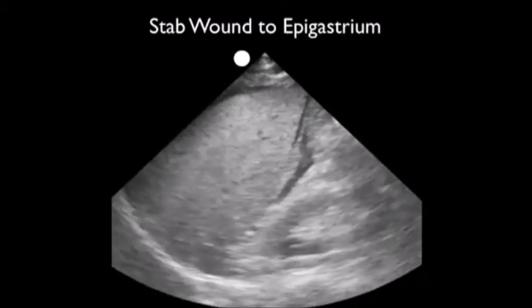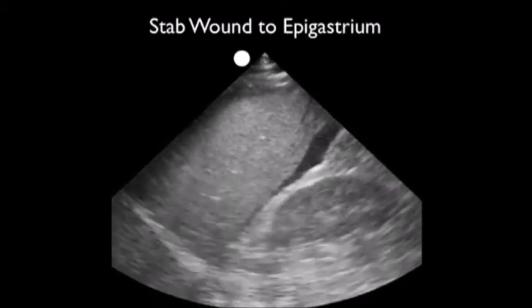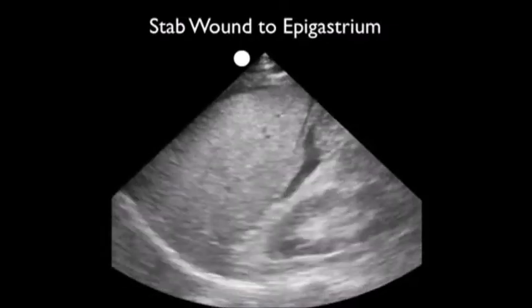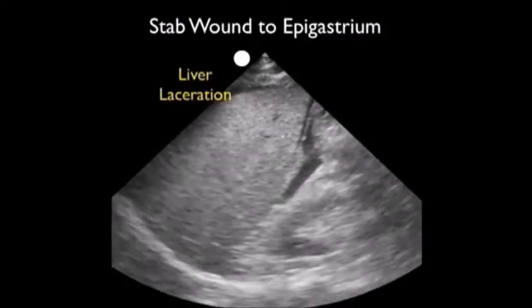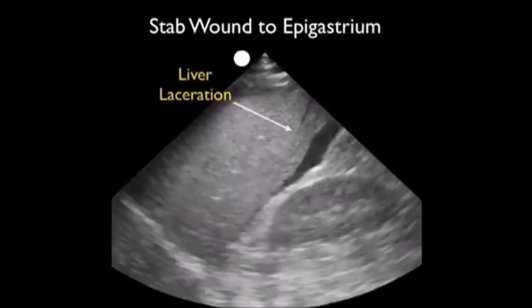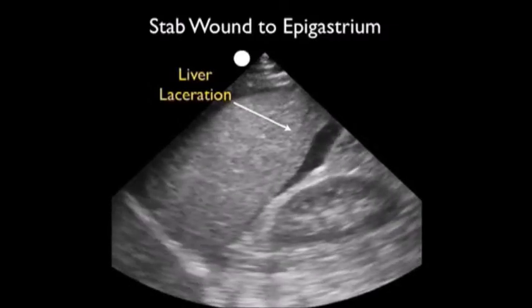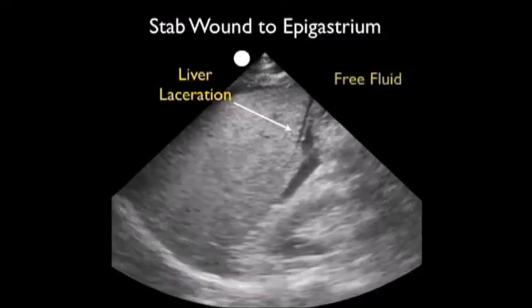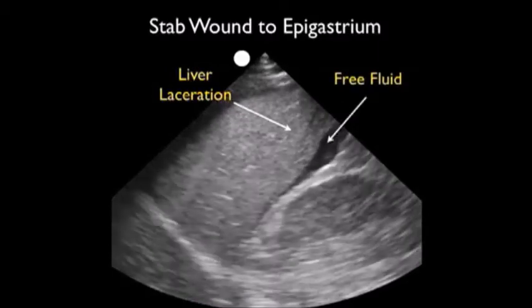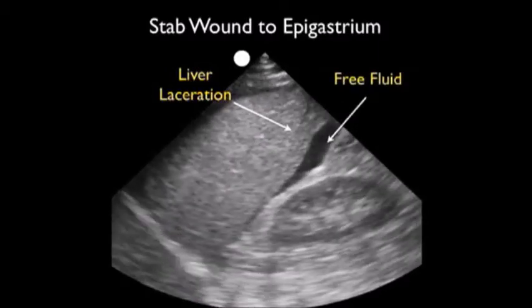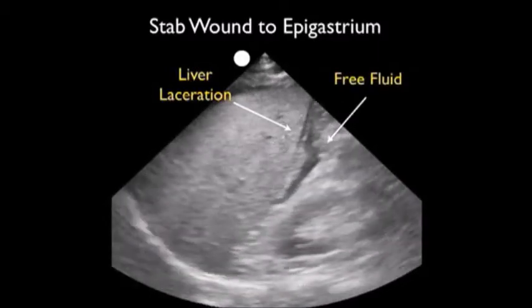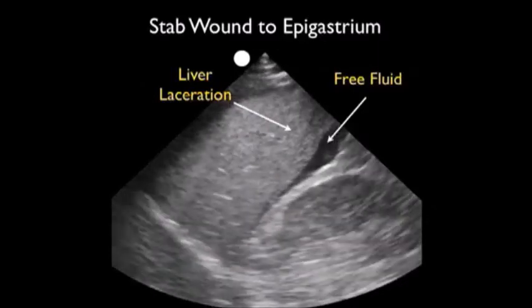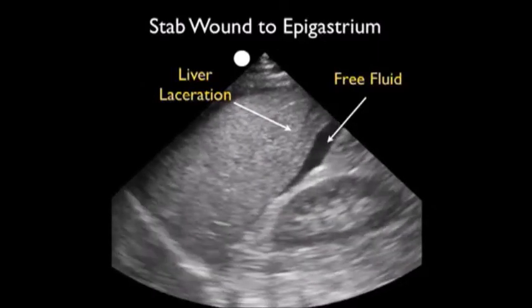Here's a video clip from a patient who was stabbed with a large knife to the epigastric region. As we look at the right upper quadrant, we can see a linear liver laceration extending through the medial aspect of the liver. We also appreciate a large amount of fresh fluid — that dark or anechoic collection — layering out posteriorly to the liver and extending into Morrison's pouch, the hepatorenal interface.